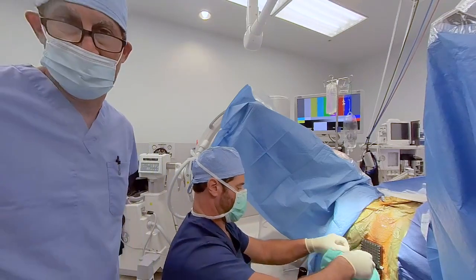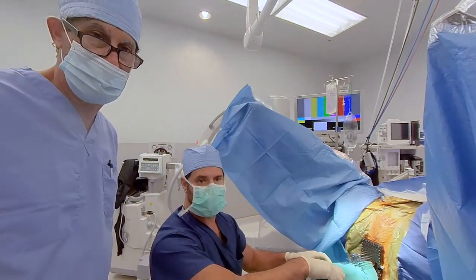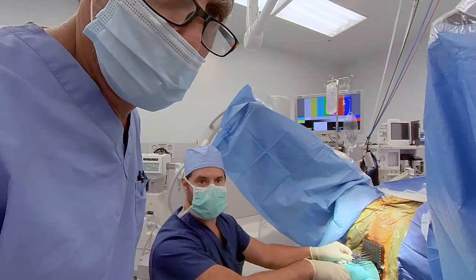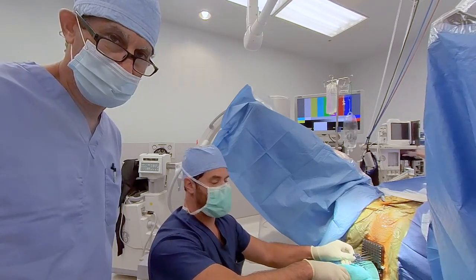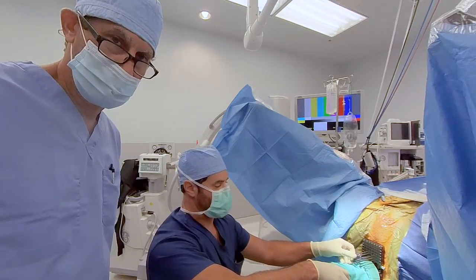So the next thing Dr. Terranova is going to do is get a longitudinal picture and make sure all the needles are at a submucosal position below the bladder. Yeah. It's working really nicely. These are all pretty good. That's good.